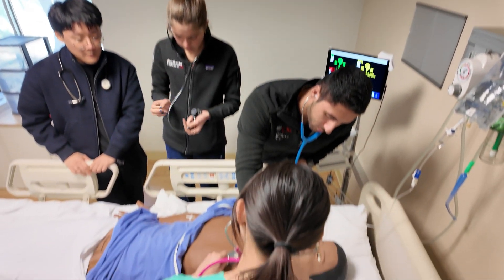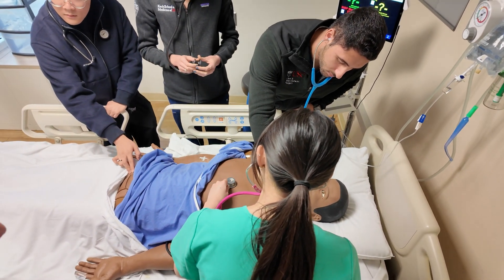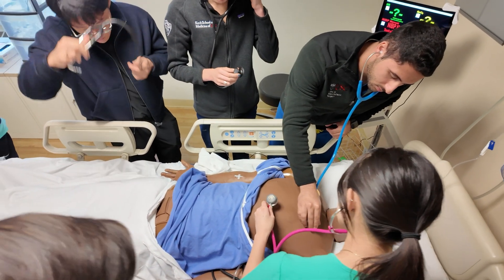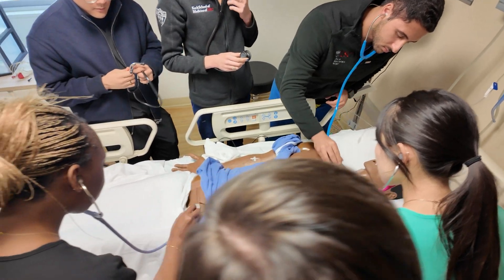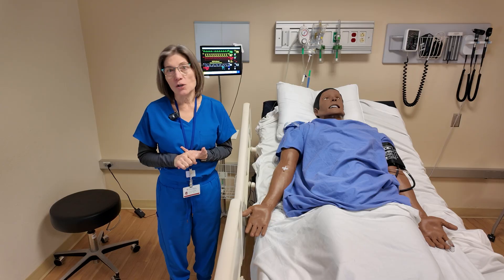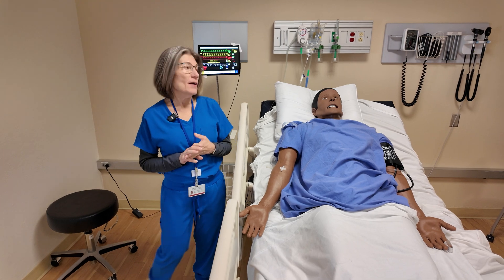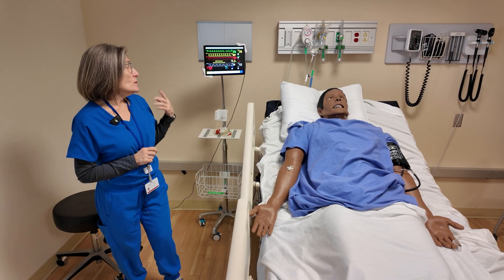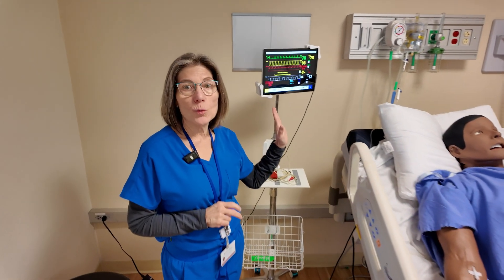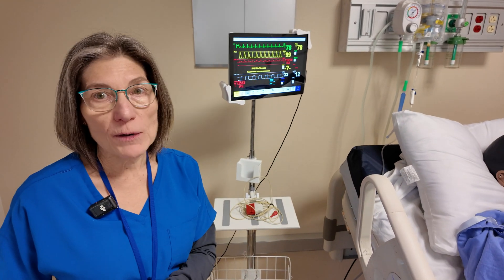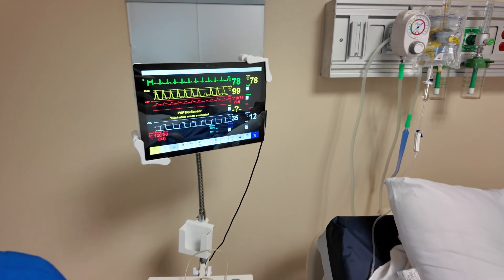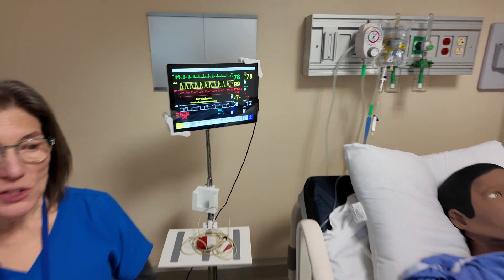We can vary the complications in the patient — we can vary the difficulty that the patient might have breathing or communicating based on the scenario we're utilizing for the day. The students also have the ability to see a patient monitor, which is very indicative of what they would see in a hospital setting, and it will reflect what the mannequin has been programmed to do.